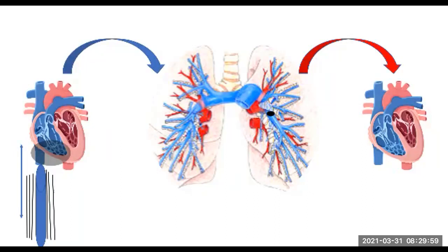Much reduced, all right? So it's a much reduced amount. So how much is going to get into the left ventricle? Much less as well. So are these going to get larger or smaller? Smaller. They're actually going to become a little bit smaller, because the actual volume that's inside is less. So we go to Starling's law. So what did we say? If you stretch it, it can contract. Are you stretching it? So how much can it contract? Very little.